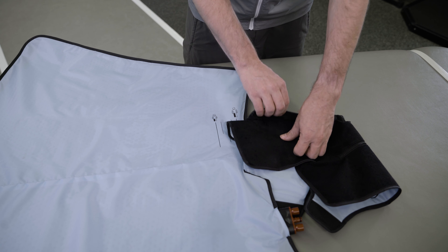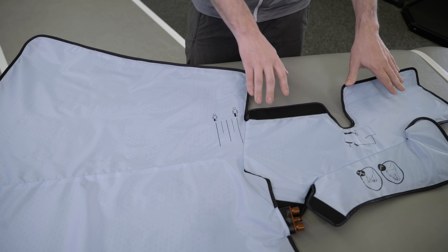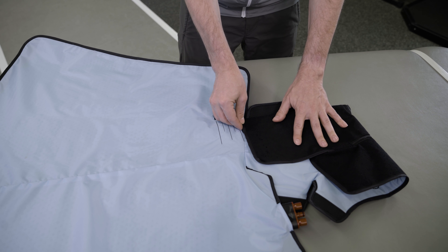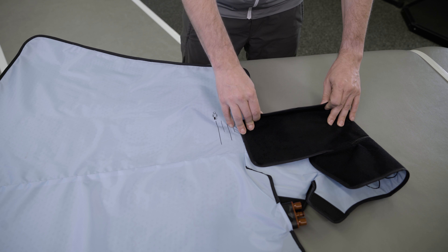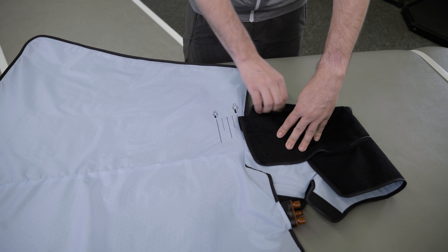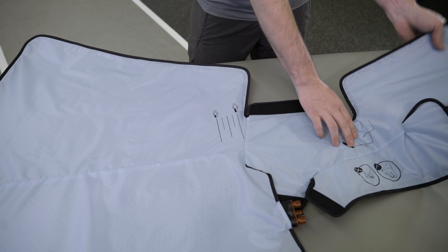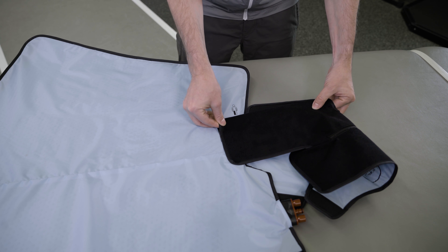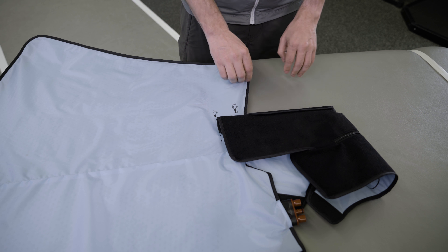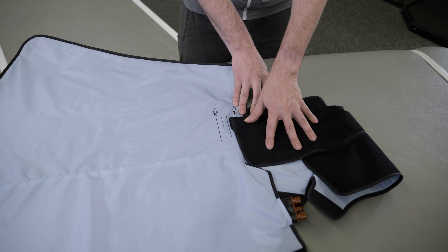To lengthen the wrap for a longer inseam, first detach the hook and loop of the boot section of the wrap so the entire wrap lays flat. Fold the boot section over so that the top edge aligns with the lower marker. This will add approximately one inch to the standard inseam length. Secure the boot in place by folding. To shorten, this will subtract approximately one inch from the standard inseam length. For optimal fit, you may place the top edge of the boot anywhere between the upper and lower markers.